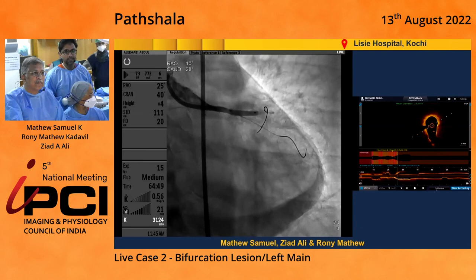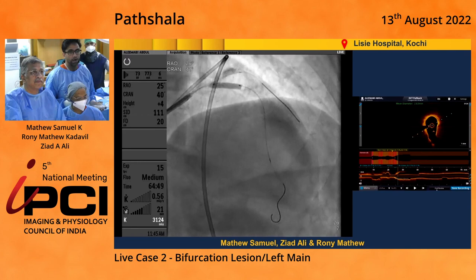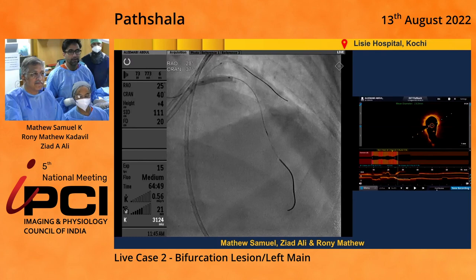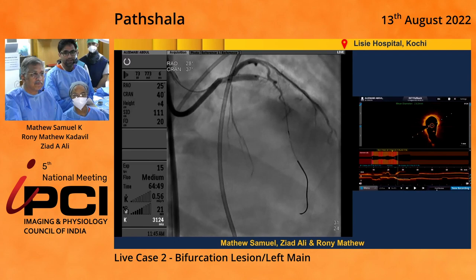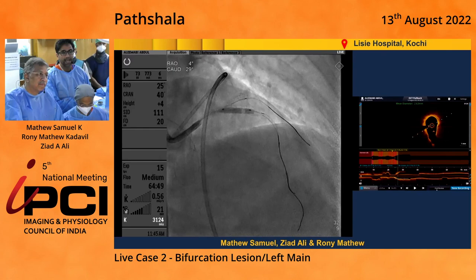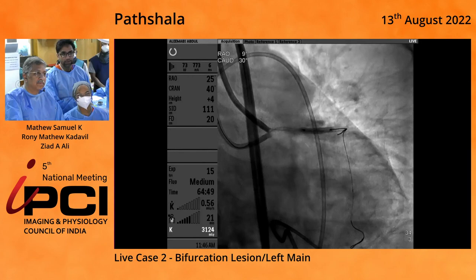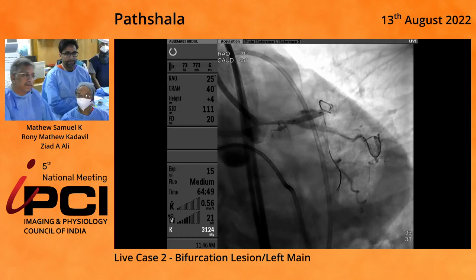We immediately used a 3.0 compliant balloon and stopped the bleeding. We made sure that we had perfusion into the circumflex. And then the next step was to put a pericardial drain in to stabilize the patient. We were able to get the blood pressure back. Then we used a double guide system - a ping pong system. We had a 275 stent protruding into the left main. And despite the crush, we were not able to advance the Graftmaster into the vessel despite multiple attempts.